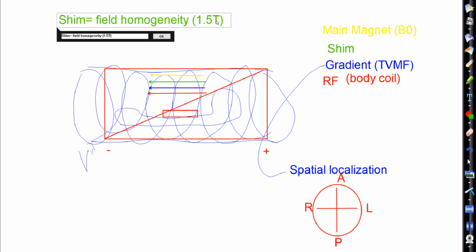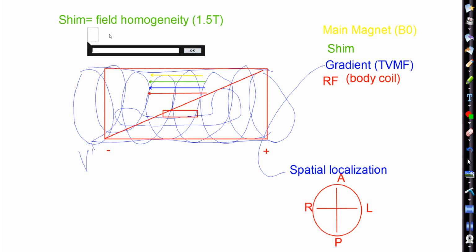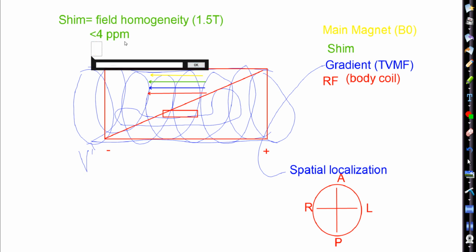So field homogeneity is usually measured in, do you remember the units for homogeneity? PPM. And typically if the engineer and the physicist want to get it below what? Below 4 ppm, for it to be ready to go for scanning patients. If we have a very homogeneous magnet, we get great fat saturation.